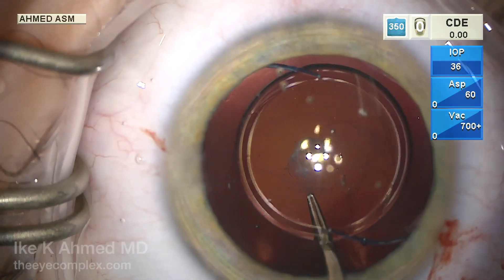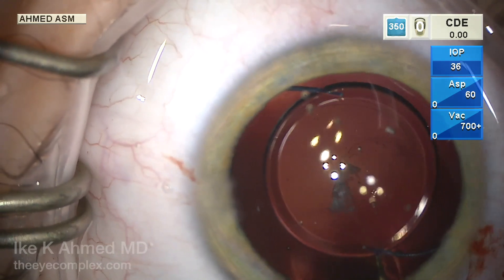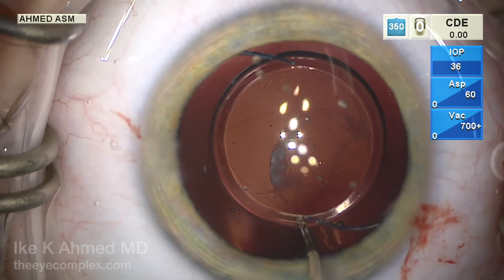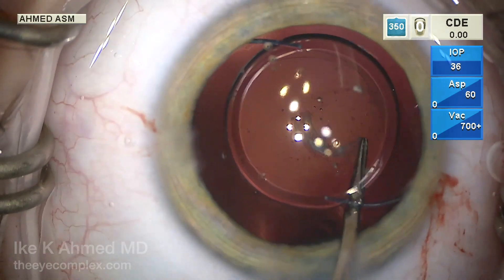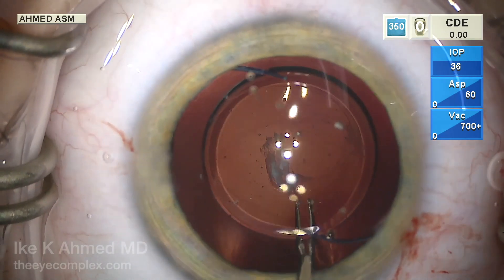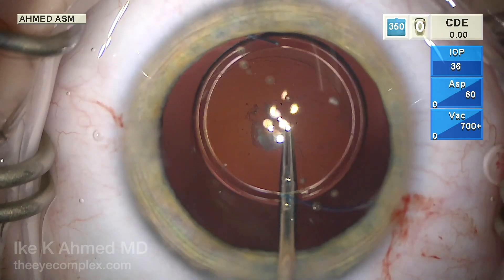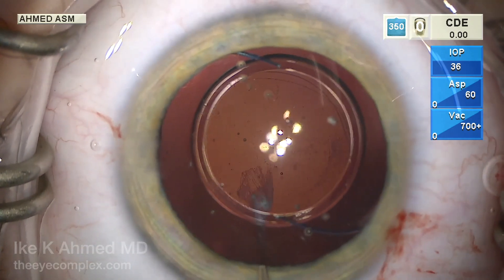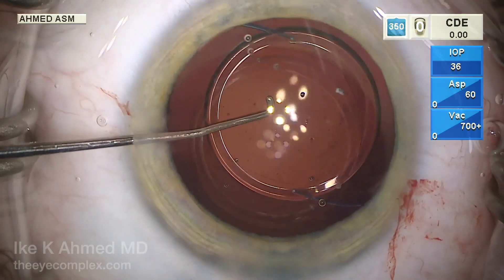This is performed in a central fashion. Once we complete this posterior rexis under the IOL, we will capture the optic through the capsular rexis. We've put the lens in first just in case there's a problem — at least the lens is in the bag. In this case, the rexis goes well, and it's also important to do this rexis to remove that central opacity.